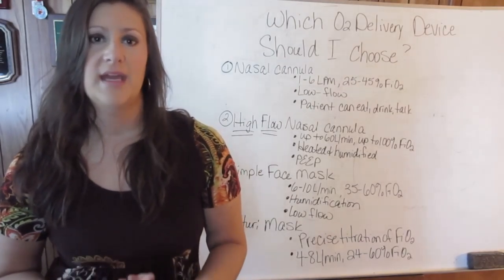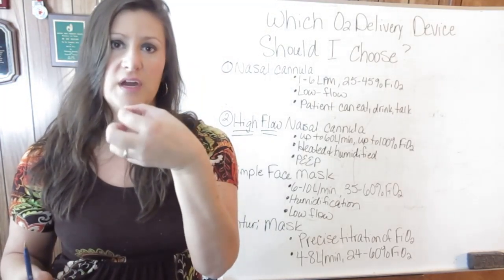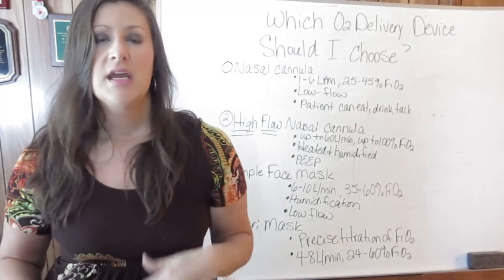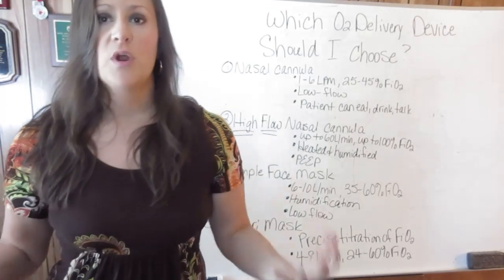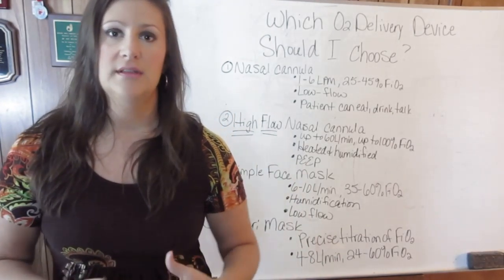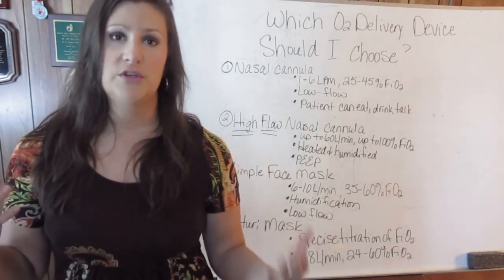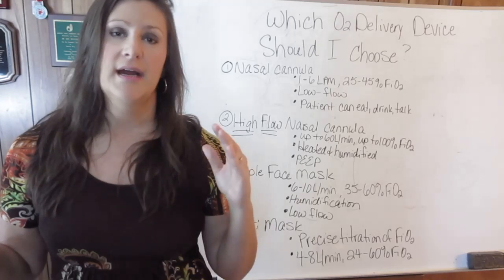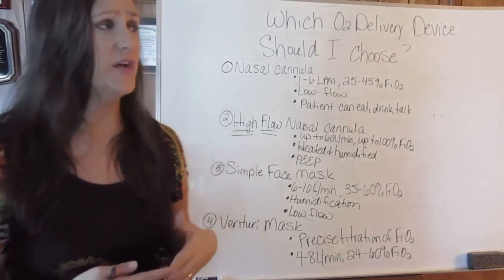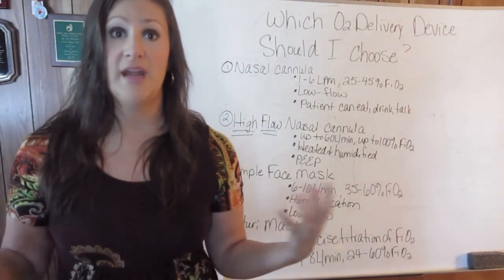And with a Venturi mask, it is very, very precise based on what you dial that FiO2 to, or the adapter that you connect to the device. So the Venturi mask, if you run into a question on an exam and you have a patient that's a COPD patient and they're acutely desatting, then the Venturi mask is absolutely going to be your oxygen delivery device of choice.